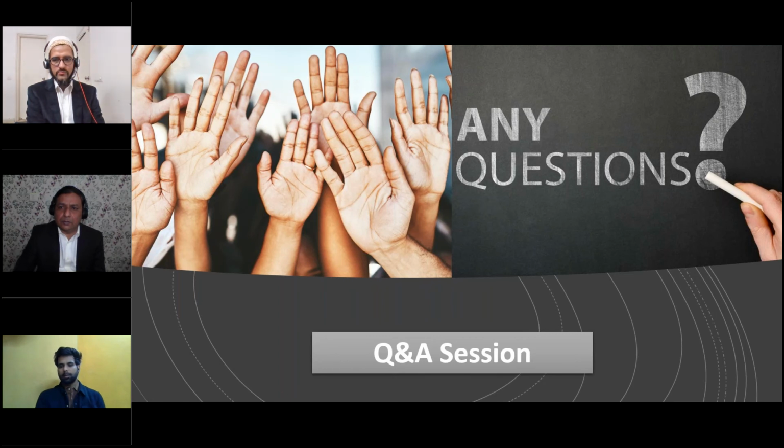And we have another question from Tarun. Whether new medical device development includes new software development for the device as well or not? Yeah, software development itself is a part of medical device development. In a lot of devices, software is part of your system requirement specifications. For example, when I said user requirements, like I mentioned, functional requirement, performance requirement, there's one thing which is software requirement.